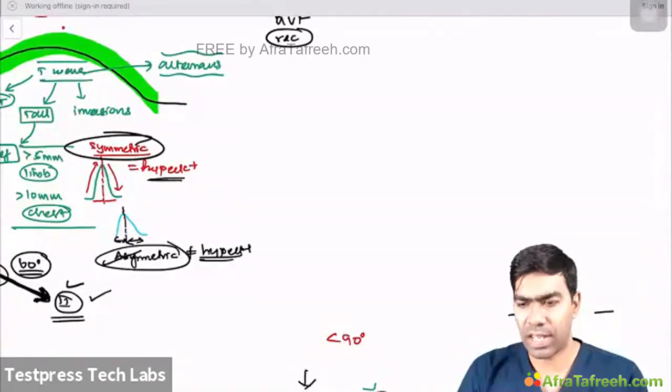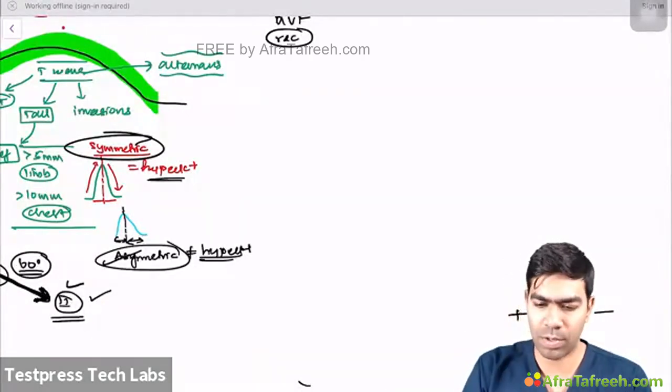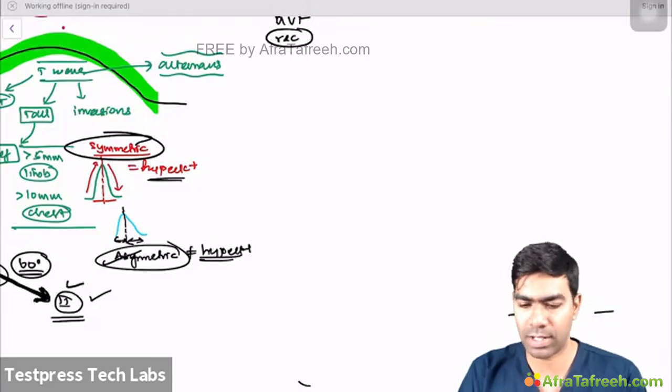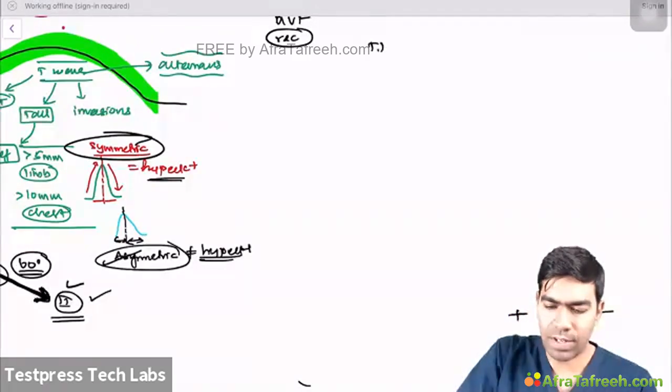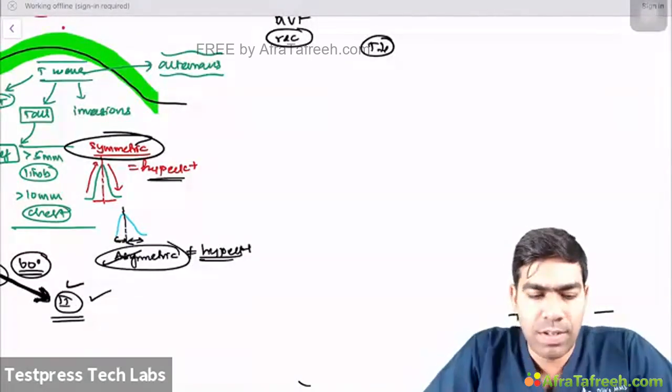What do you mean by intracranial hemorrhage is what you're talking about. So they can produce, not like it cannot produce. ICH can produce a variety of changes again. So now we are talking about T-wave inversions. So what are the conditions that produce T-wave inversions?